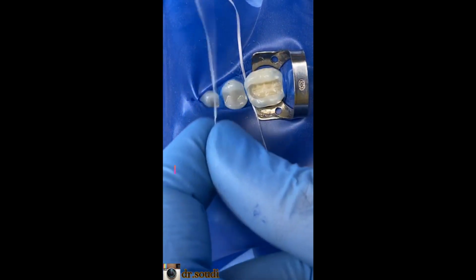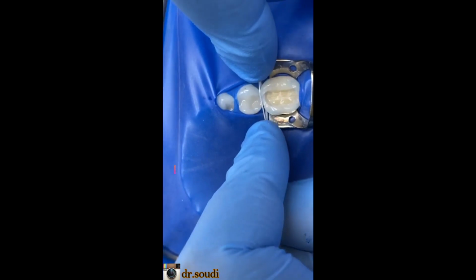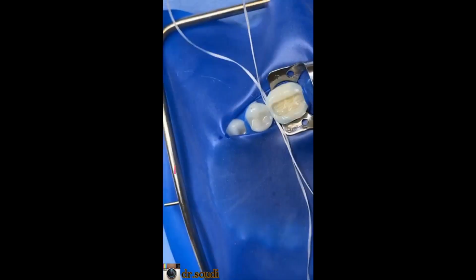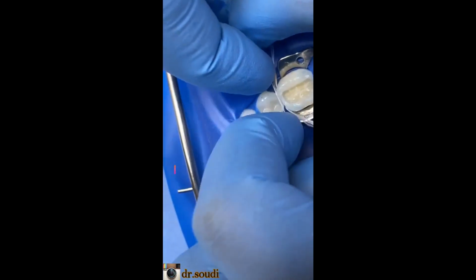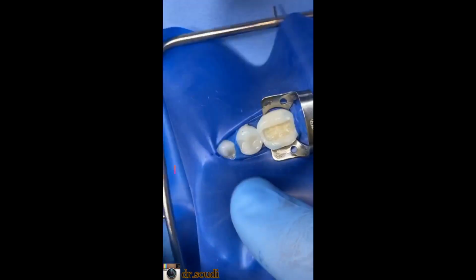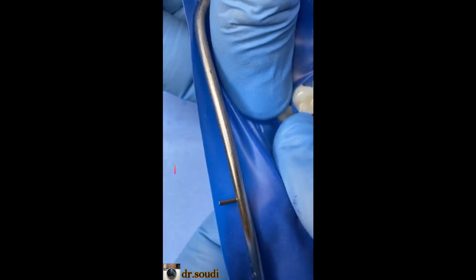So what will I do? I will bend it again like this without removing. I will bend it like this and we'll go for second insertion. Okay, now if you have more, you can bend it like this again. Don't remove the floss until you completely remove it. You make sure that the sheet is downward. There is no sheet now here. Okay, make it for the other two teeth like this.